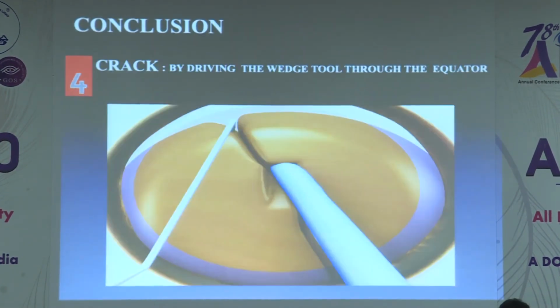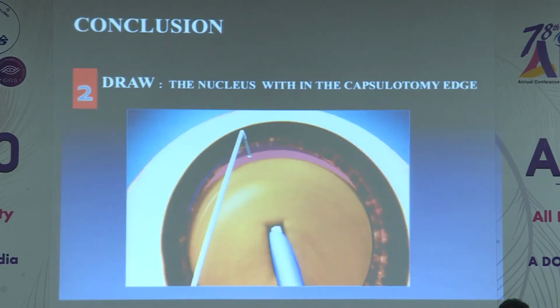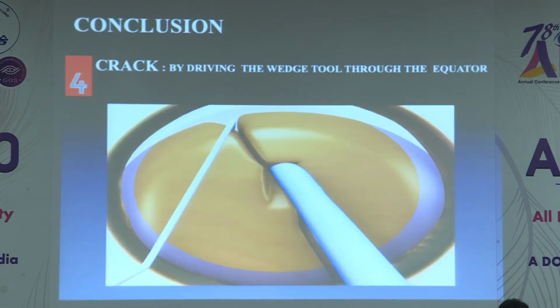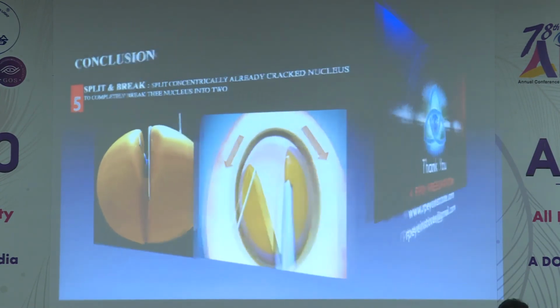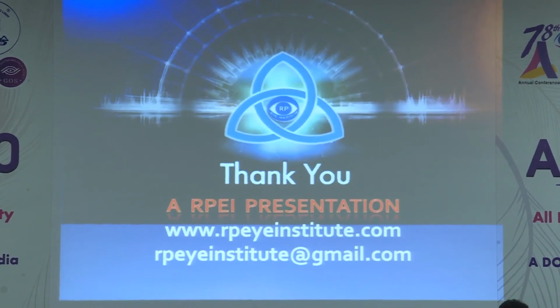So just to conclude, if you are holding the nucleus at the equator, hooking it around, and then cracking at the equator, and splitting the nucleus into two complete pieces, this is the basic principle of this device and the cracking of the nucleus with the Terminator. Thank you very much.